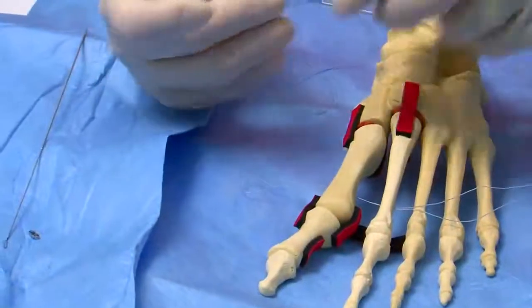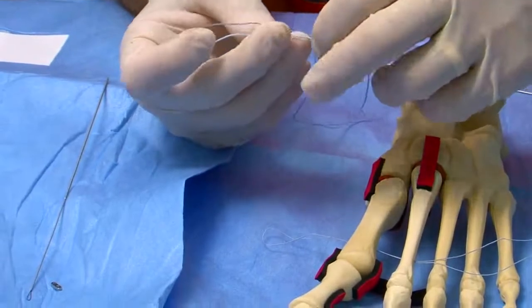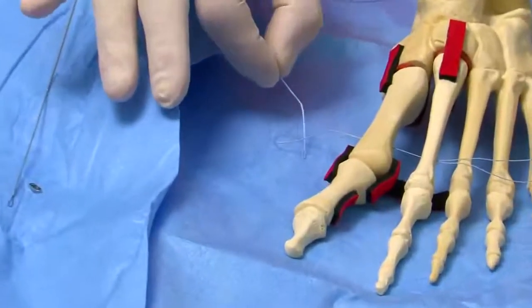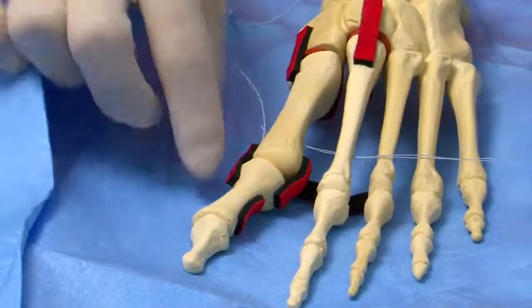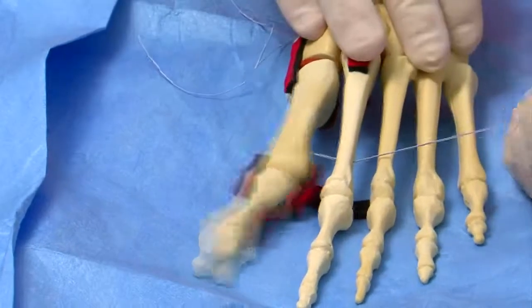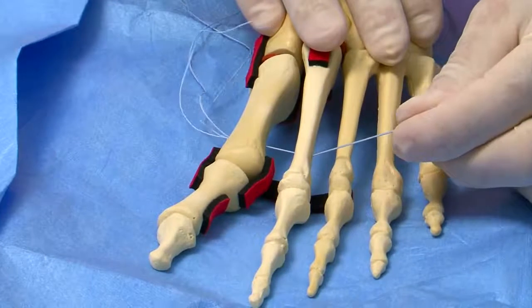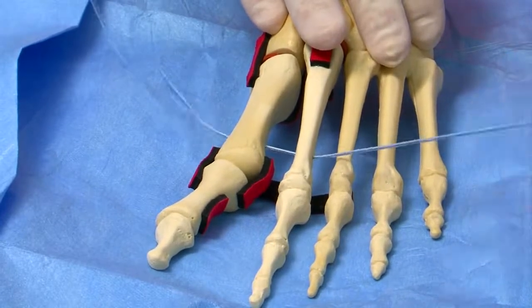At this time, the original tail that the one part of the mini TightRope was passed through will be placed in the loop of the 2.0 fiber wire to be used as a suture passer, and this tail will be passed through from medial to lateral. And once again, using a hemostat or other grasping device, the mini TightRope can be pulled through a single 1.1 millimeter hole.